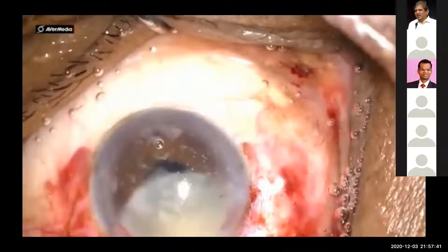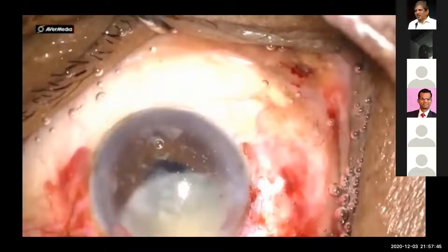That is what you have to understand. So the amount of astigmatism which you are going to reduce by making your incision very posterior is very less. Mainly it is the length of the incision which is very important. Thank you so much.